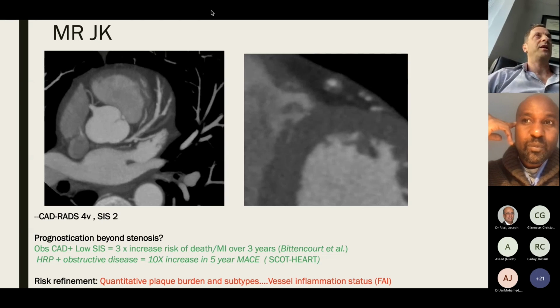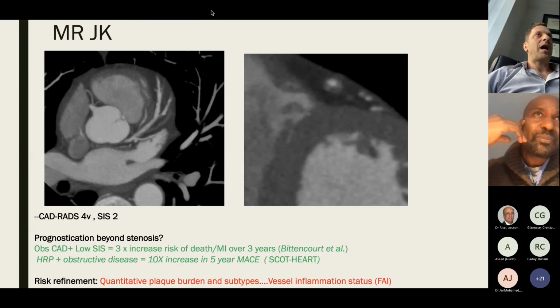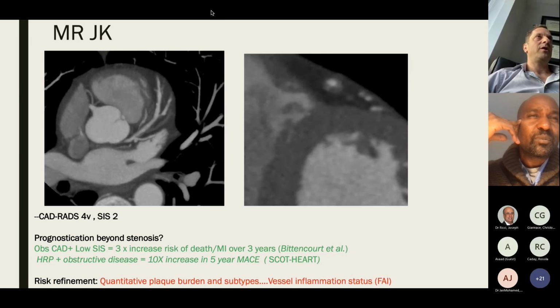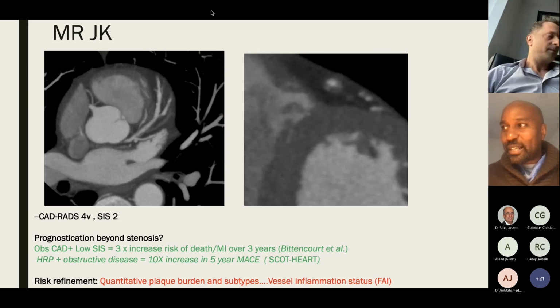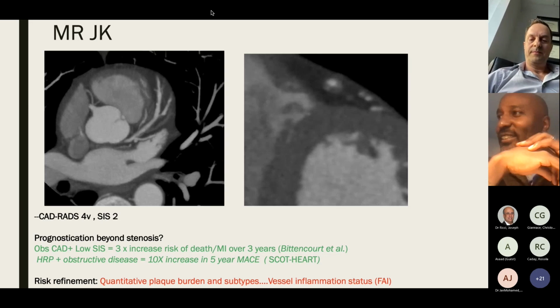So for example, for those plaque morphology cases where they're higher risk, i.e. low Hounsfield units, not a lot of calcium, do those patients have very high calcium scores? Because otherwise it's really hard to reconcile all of this. You know what I mean? Do you understand what I'm trying to say? Absolutely. There's a lot of different messaging. Sometimes it's hard to say, is this all consistent?